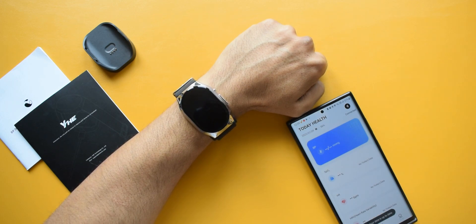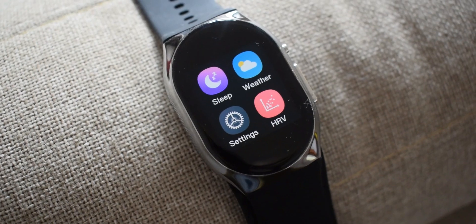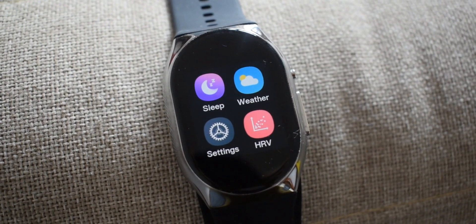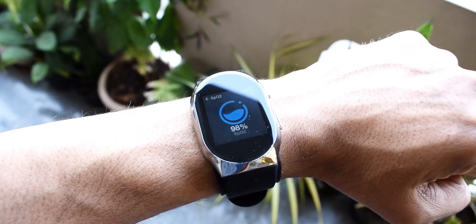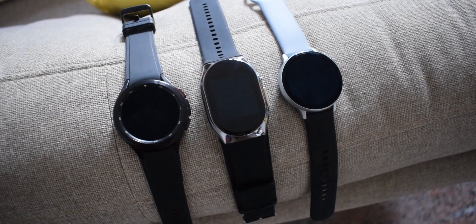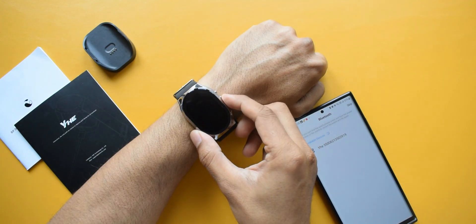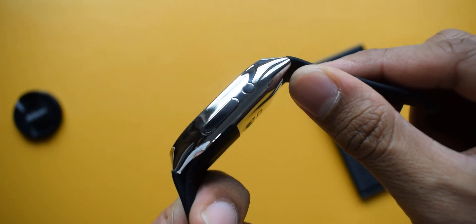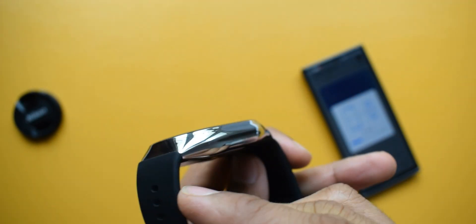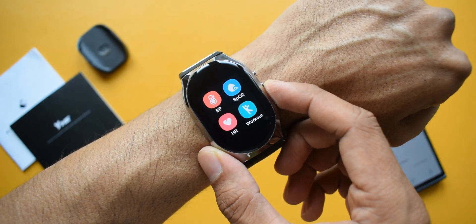Now, how does this watch look on the wrist? For me it's a modern-looking design — neither too small nor too heavy, and it fits well. You only need to wear it snug when measuring BP; the rest of the time you can loosen it. Comparing sizes: the Samsung Galaxy Watch 4 at 46mm and Galaxy Watch Active 2 at 44mm — this watch looks perfect on my thin wrist. There are just two buttons: one turns the screen on or off, the other accesses the app menu, and the first button also acts as the power button. The user interface is simple and intuitive with a pretty good display.